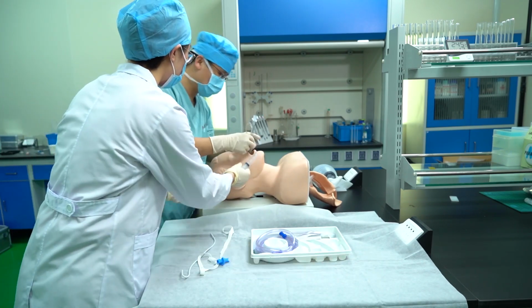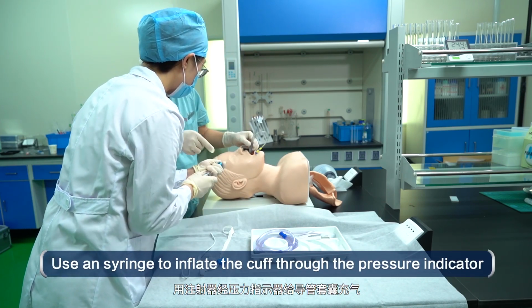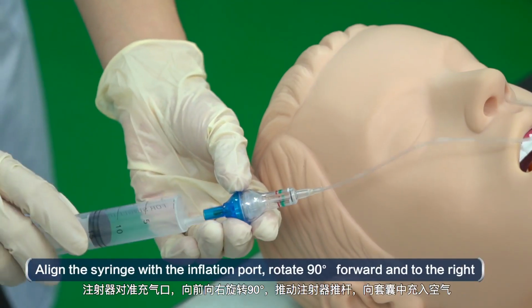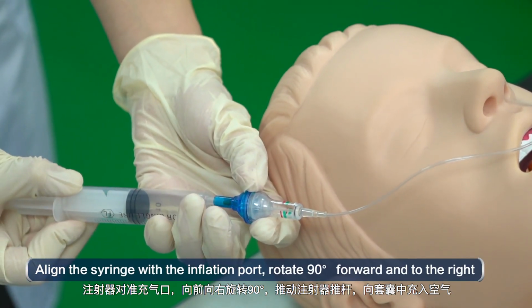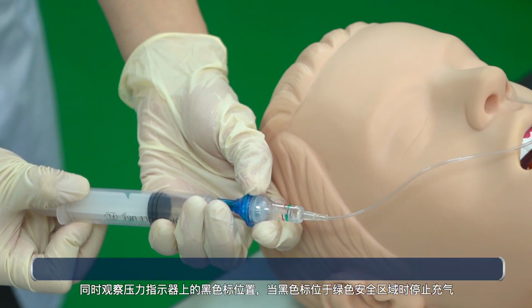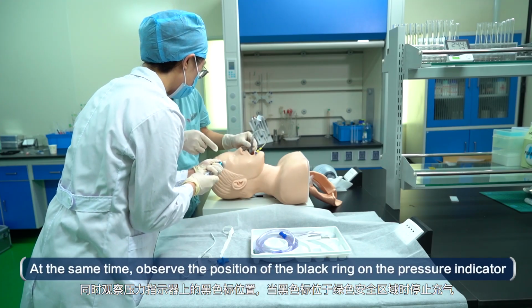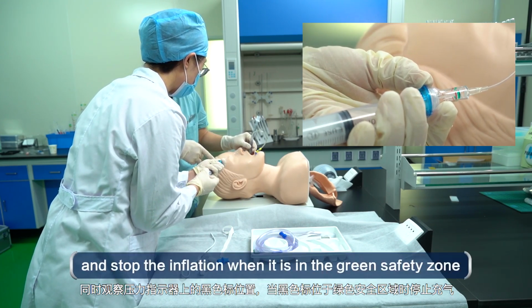Cuff inflation. Use a syringe to inflate the cuff through the pressure indicator. Align the syringe with the inflation port, rotate 90 degrees forward and to the right, and push the syringe rod to inflate. At the same time, observe the position of the black ring on the pressure indicator and stop the inflation when it is in the green safety zone.